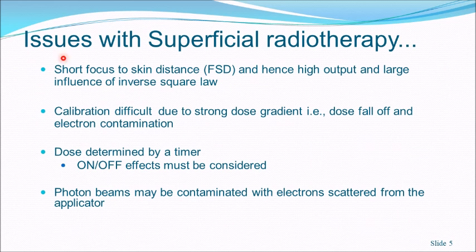There are several issues with the superficial radiotherapy. Due to the short focus to skin distance, you get a very high output and large influence of inverse square law. Shorter the SSD, greater the inverse square law fall off, right? So there is a large influence of inverse square law.